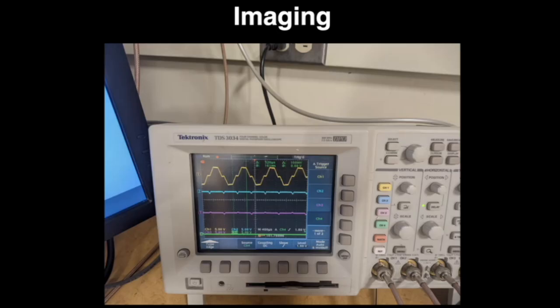So this is one reason why the body gradients are limiting to us, and we would like very much to get our hands on local gradients so that we can get past these performance limits that are imposed on the systems by the body gradients. So you don't spend this much time switching between your readout directions, and you can be much more efficient with acquiring your data.